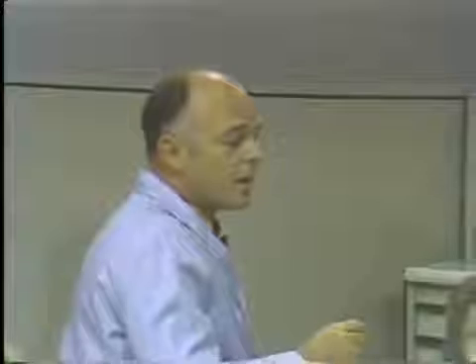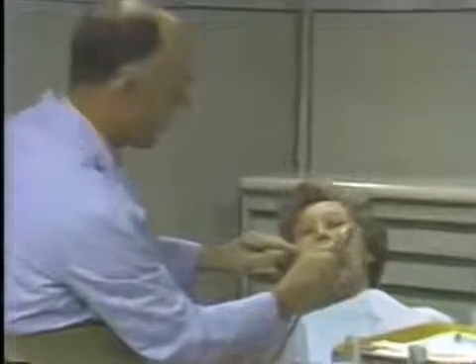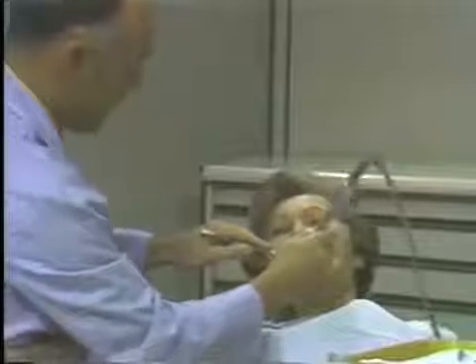Also, you may use this position for slicing if you're using a lightning disc and doing any disking. This position will serve very well for mandibular right quadrant, and maxillary right quadrant, although you will have to raise the chair in order to see well.